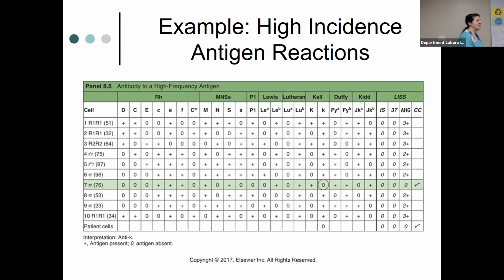Okay, so what can we do? What is blood bankers going to do with all these positive reactions? Does this patient have any underlying antibodies? Hard to say, right? I mean, we could do rule out with that one cell, but not everything is going to be ruled out. So we have another treatment.